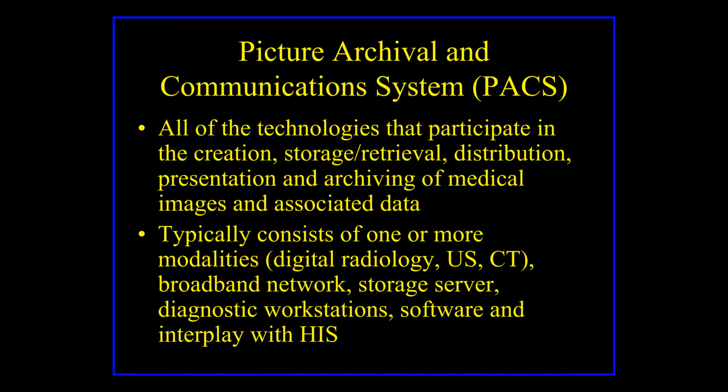Okay, PACS and DICOM. PACS is an acronym that stands for Picture Archival and Communication System. A PACS system is a software system, and the hard drives in a computer that store images for you. It's where you will archive and store all of your digital x-rays. If you have ultrasounds, you'll store them on your PACS system. If you have CT in your clinic, or you send a dog out and they send you the CT image, you can store those on your PACS system.